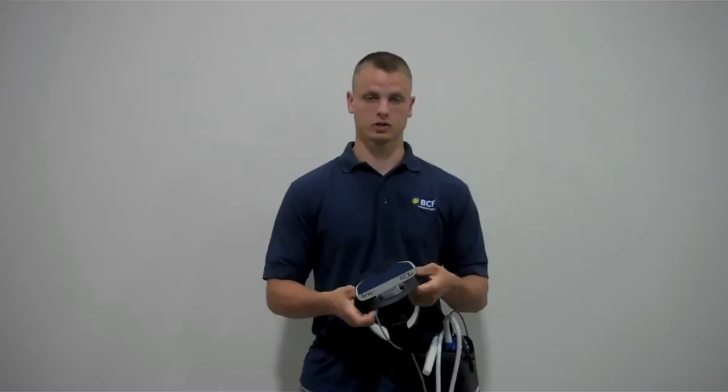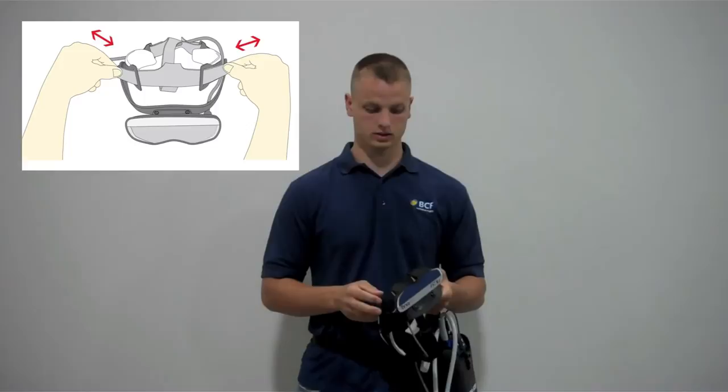To get them closer to your eyes, you want to loosen up the tabs on both sides. To get them farther away from your eyes, you want to tighten up both tabs.